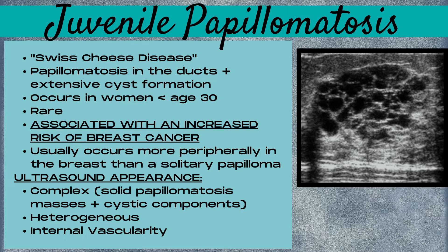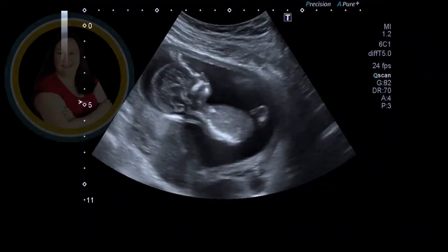The ultrasound appearance of juvenile papillomatosis is going to be complex. There will be solid papillomatous masses plus multiple cystic components present. It will be heterogeneous with internal vascularity.